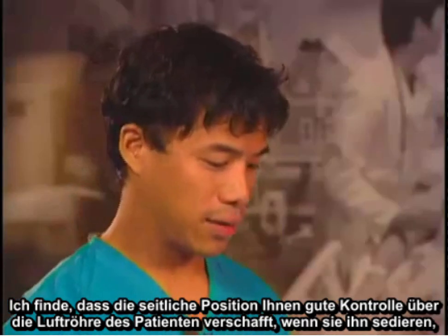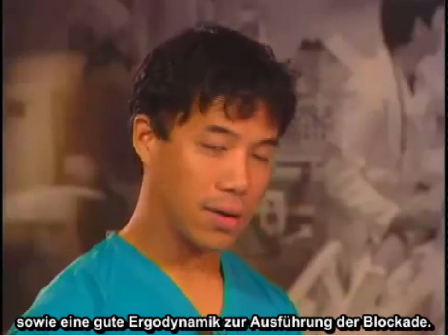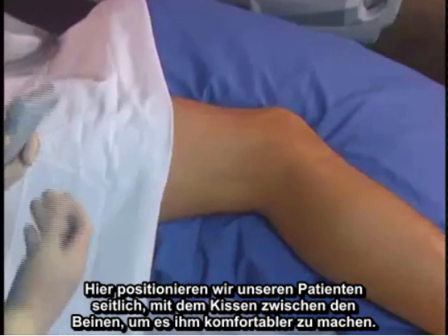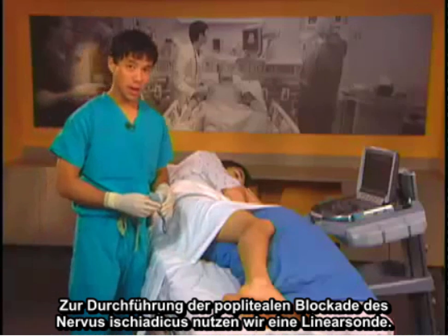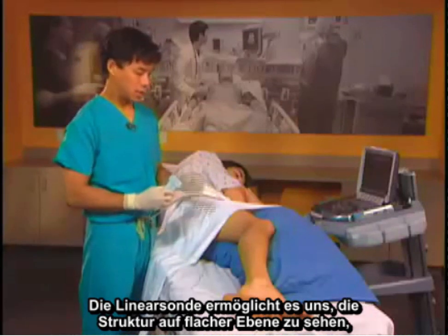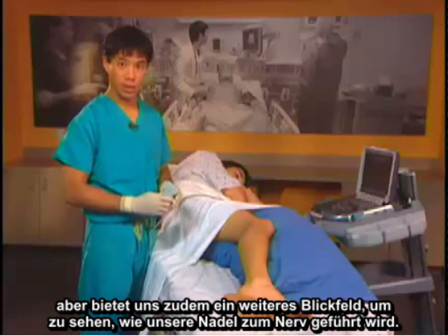A lateral position gives you good control of the patient's airway if you sedate them, as well as good ergonomics to do the block. Here we have our patient positioned laterally with a pillow between the legs for comfort. To do the popliteal sciatic nerve block we use a linear probe, which allows us to see structures well in the shallow plane and gives us a wide field of view to see our needle approaching the nerve.